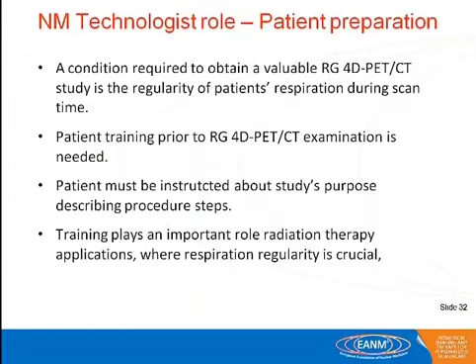So which is the role of technologists in all of this? Well, patient preparation. You really need to talk with the patient and be able to have him cooperate with you. And patient training is needed. And the patient must be instructed about the study's purpose, because sometimes they get upset, why do I have to do a long ride, stay there for so long; you have to explain why you are doing that. And really, training plays an important role in this, not only in gating, but also every time you do imaging for radiotherapy planning.